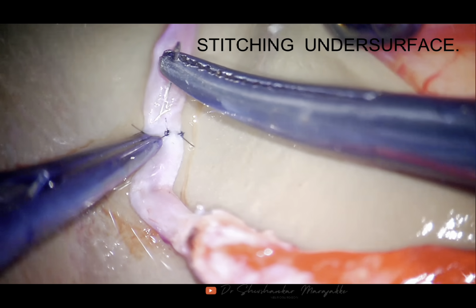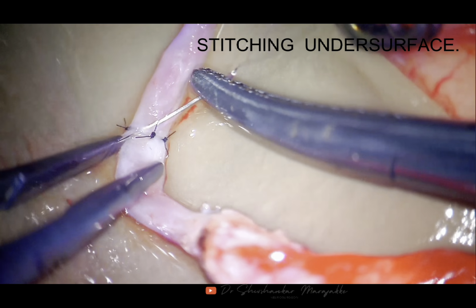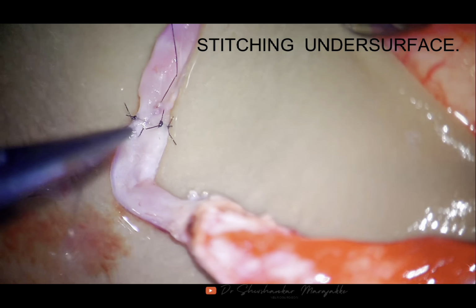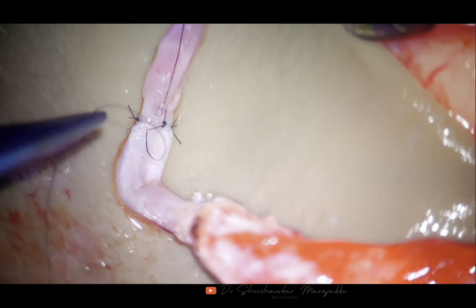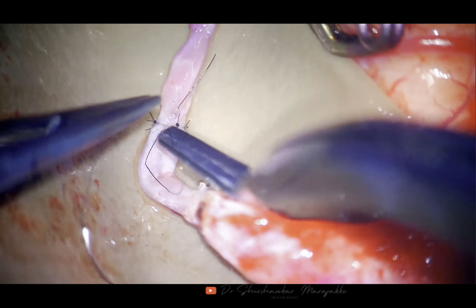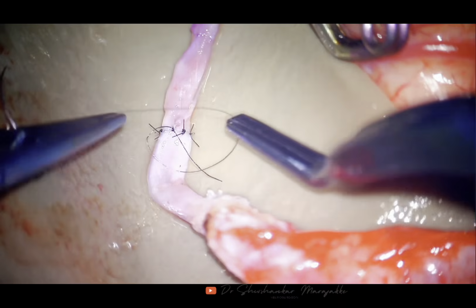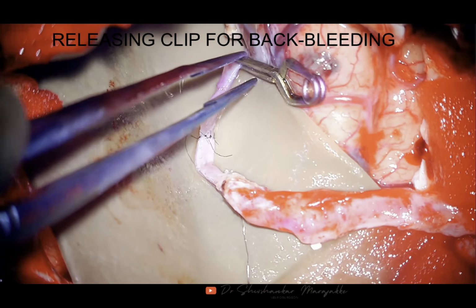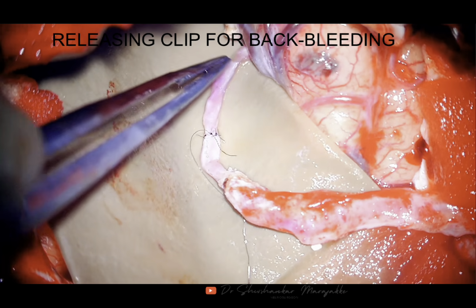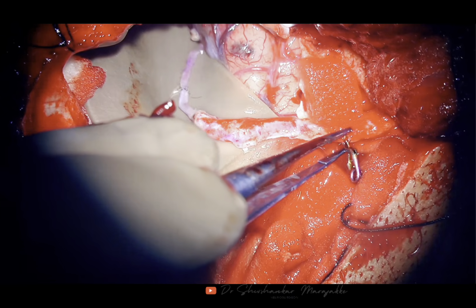So it's quite important to learn the art of anastomosis. In this unplanned anastomosis, it was absolutely not planned, but if I had not learned this technique, I probably would have had to accept either the occlusion and obliteration of the anterior temporal artery, or clip the neck above. So this completes the aneurysm here. Now I have released the distal clip first, and after that I will release the proximal, that is the STA clip.